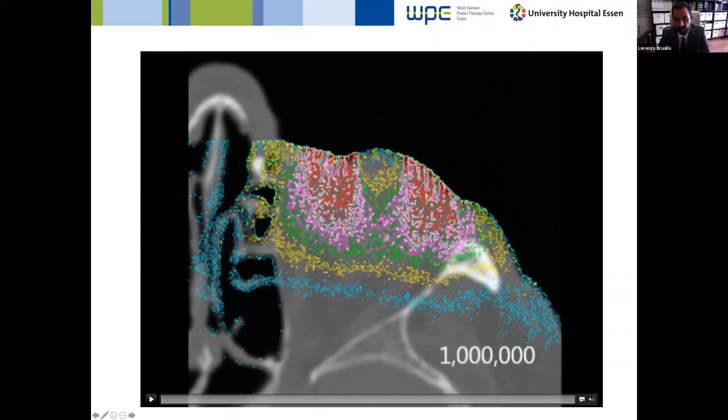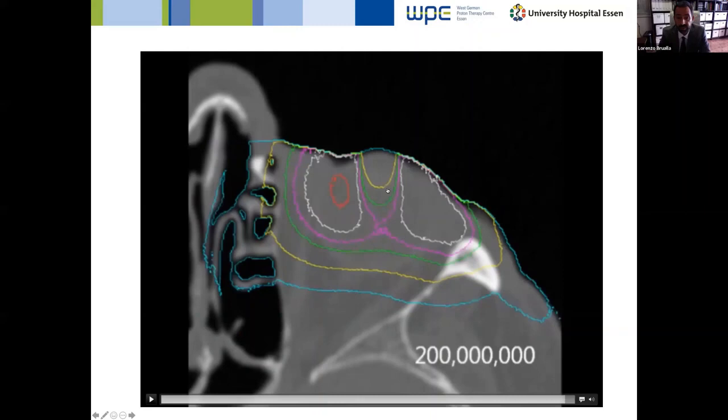So that's another caveat. When you see very smooth lines in isodose lines or very smooth plots in general in Monte Carlo, take them with a pinch of salt. Many times it occurs that some smoothing or ironing or some other algorithms have been applied. And of course, when you apply these kinds of algorithms, then all traces of statistical uncertainty are lost.